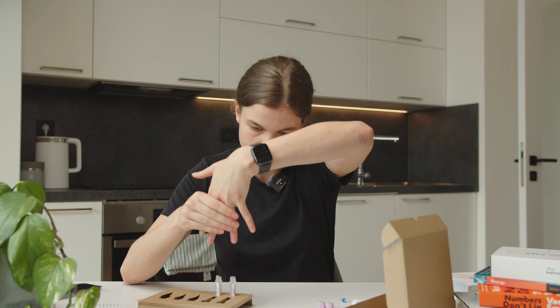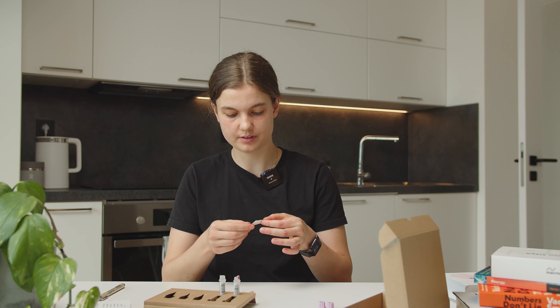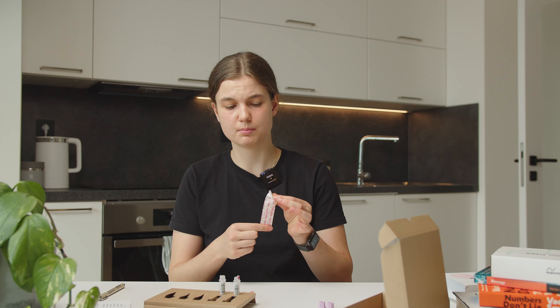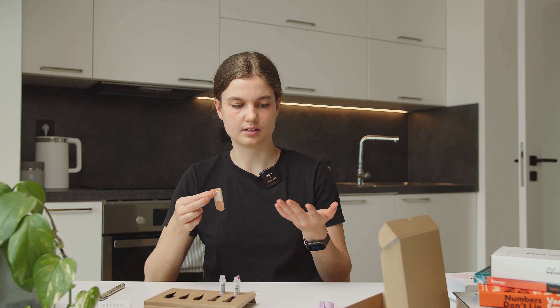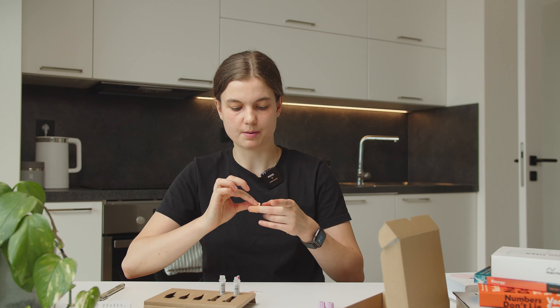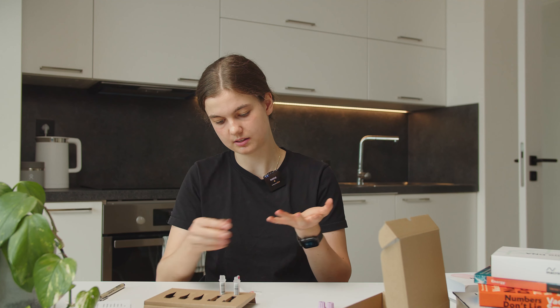I actually didn't warm up my hand before this, which I was supposed to do. But I managed to fill both vials up to the marked line. If it's a little bit less that's okay — we need about 750 microliters and these hold about 1,000. Then I'll gently rub my finger. The second cut isn't that deep so I think I'm fine.